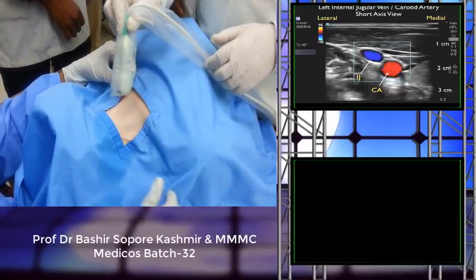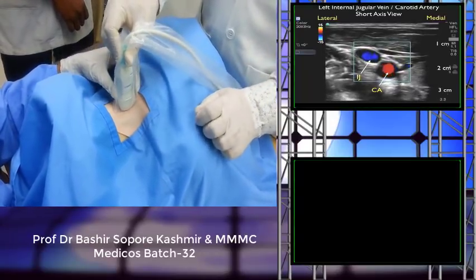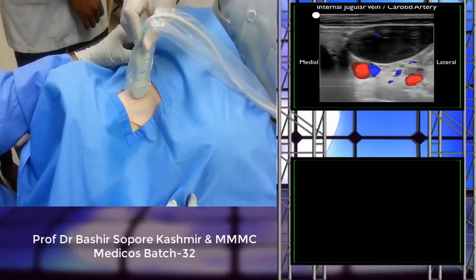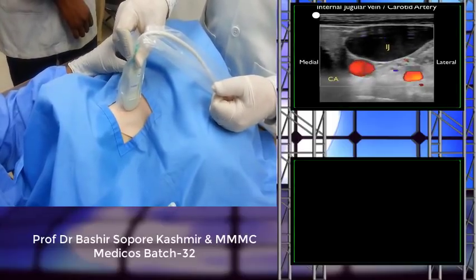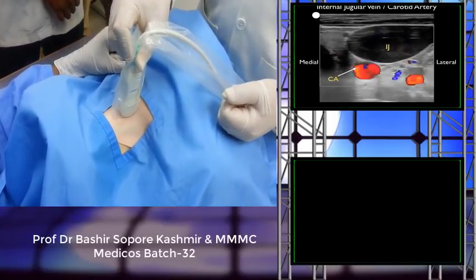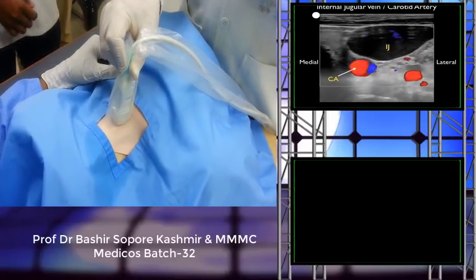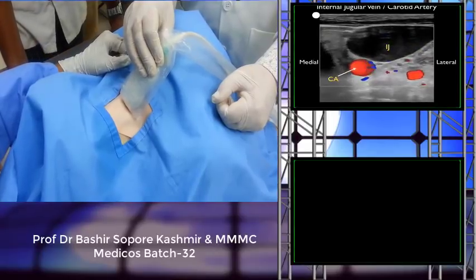another axis, the long axis. So we can hold like this also, introduce this transducer, and we can find the image. The image will be displayed, and we can make out which is vein, and the vein will be larger, isn't it? And it will be around 0.5 centimeter to 2 centimeters depth.